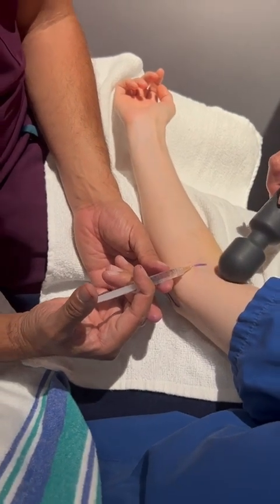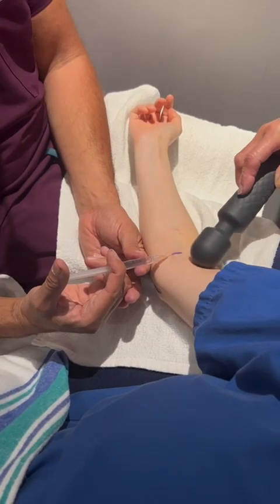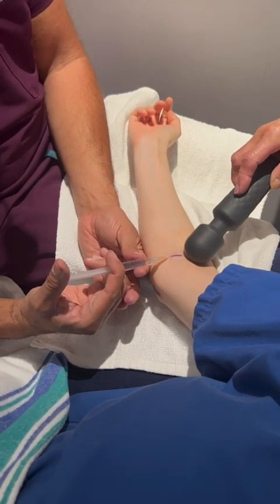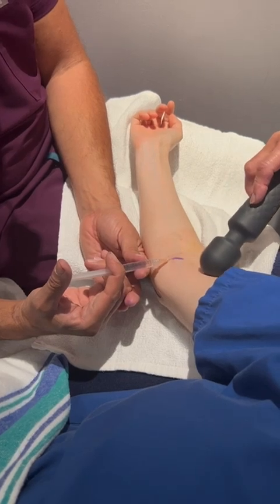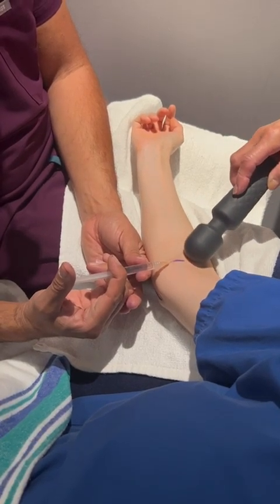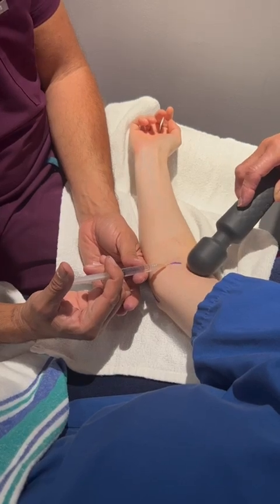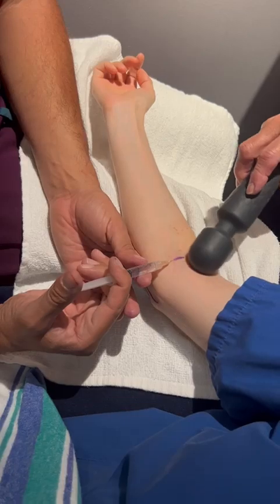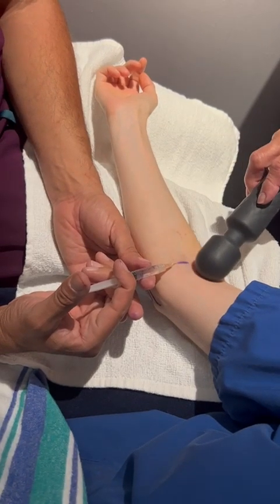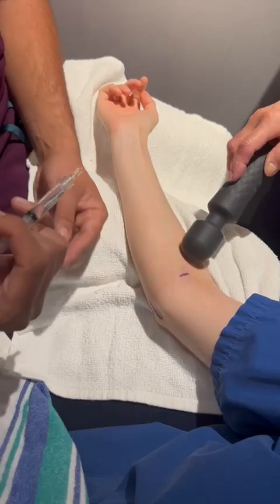I stabilize the syringe and the needle. The vibration continues. And I inject so slowly you can hardly see the plunger move in the syringe — very, very slowly. This is basically to numb the skin. No pain? Maybe like a one. This distracting device is great — we can live with a one.